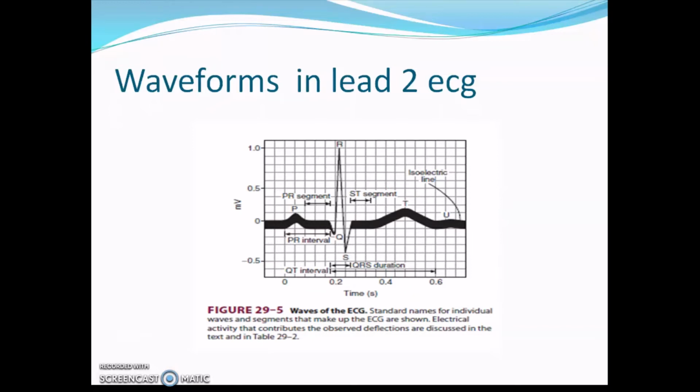So next coming to the QRS complex, the Q wave is the initial negative wave because it is a septal wave and the direction of the septal wave is from the left to right, which is against the direction of the mean axis of the heart. So it is a negative vector. So you see a Q wave.